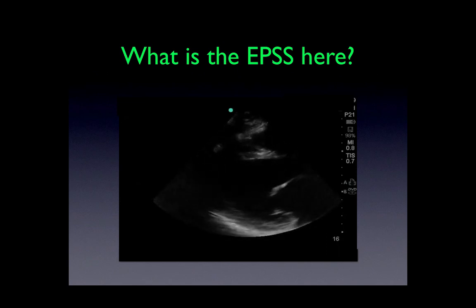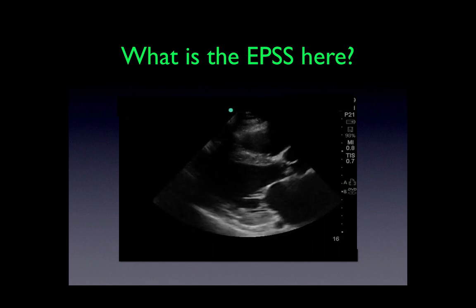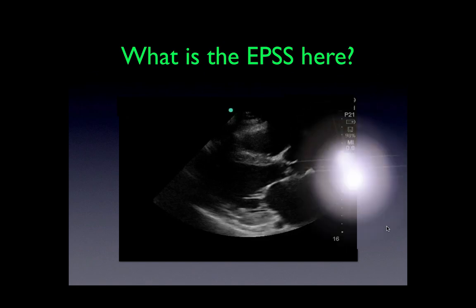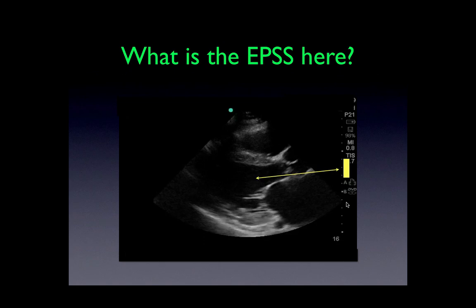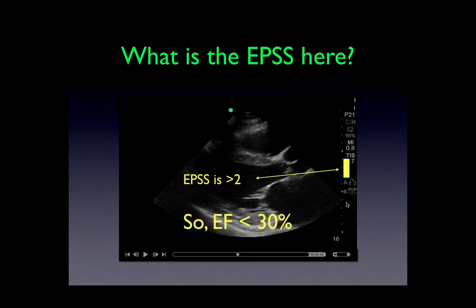Now, what's the EPSS here? Let's take a look at the mitral valve. The image is now frozen and the mitral valve is sitting over here. On the scale to the right, going from the top of the screen down to the bottom, the depth is set to 16 centimeters. Each hatch mark represents one centimeter. So this yellow bar is showing a two centimeter separation. In other words, if the separation between the anterior leaflet and the septum is greater than this, the ejection fraction is less than 30%. The EPSS is definitely greater than two — therefore, the ejection fraction is definitely less than 30%.